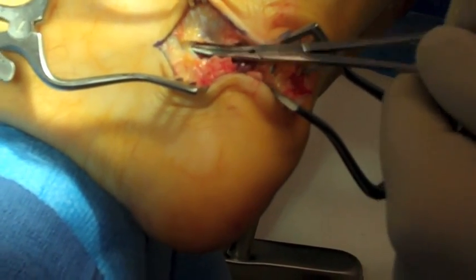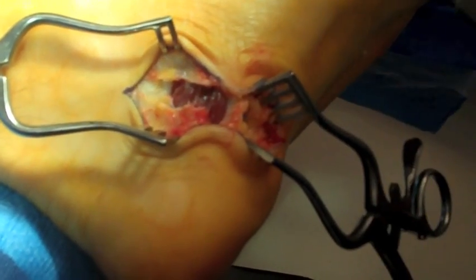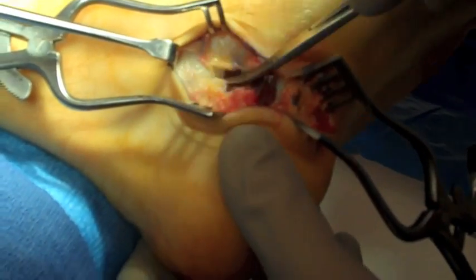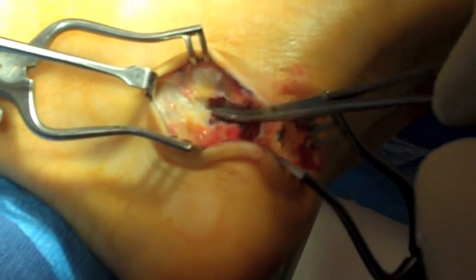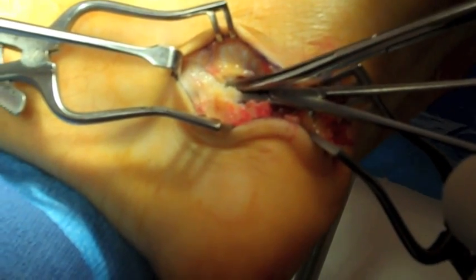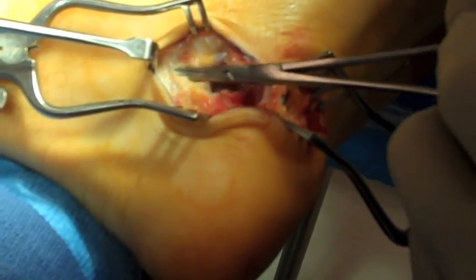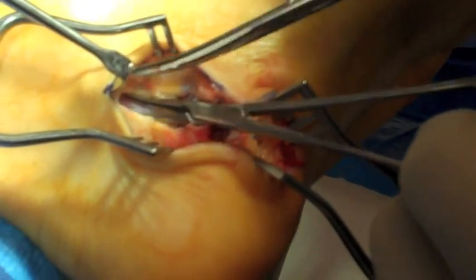The flexor retinaculum is now coming into vision at the most proximal aspect of the incision. A syn retractor is utilized to pull the incision proximally, and the flexor retinaculum, which overlies the neurovascular component, is elevated with a hemostat and then released to perform a distal tarsal tunnel release. This can be released all the way to the medial malleolus by simply going beneath the skin and tenting the skin with the syn retractor.